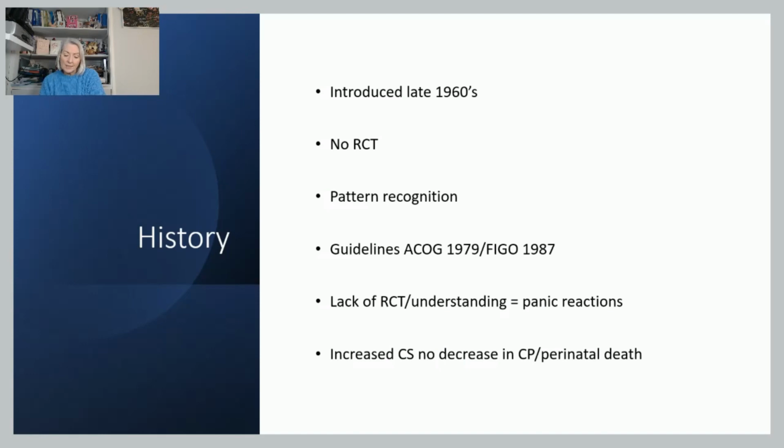So interesting really to add to that is that even back as far as 1971, Beard et al. described that even with significantly abnormal late decelerations or baseline bradycardias, the cord pHs of those babies were often over 7.25. And that pattern recognition that increased the cesarean section rates, really we were acting on false positives. So 60% of those were unnecessary cesarean sections.